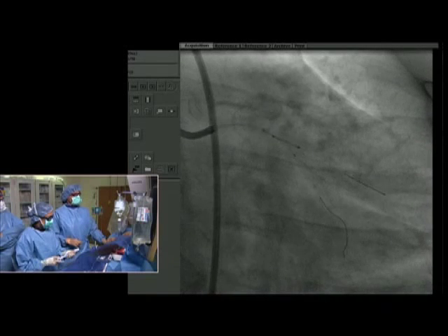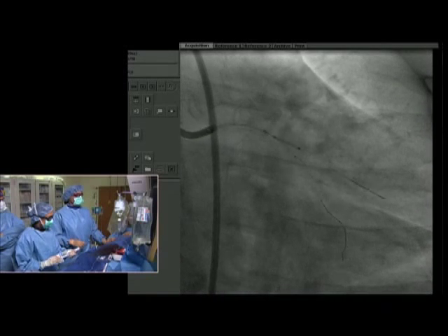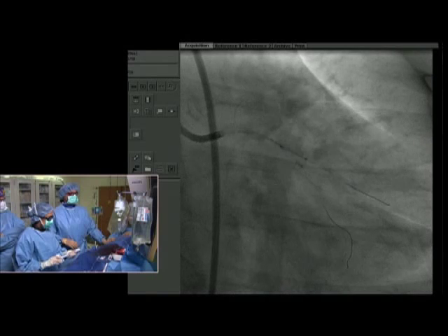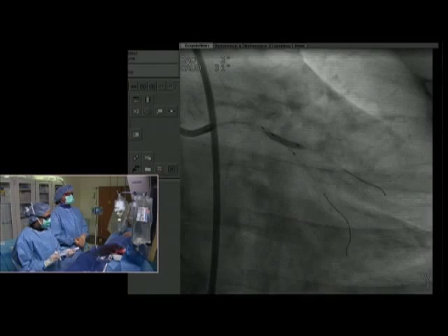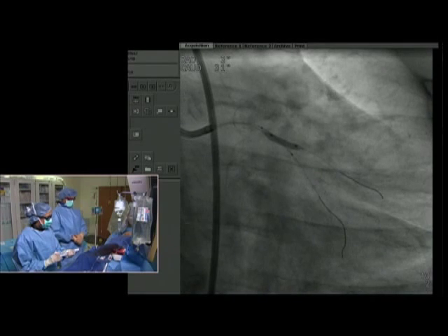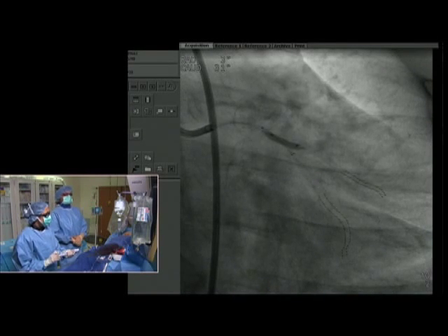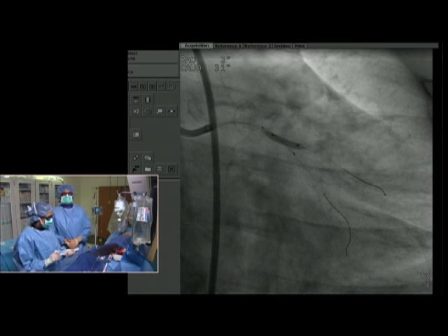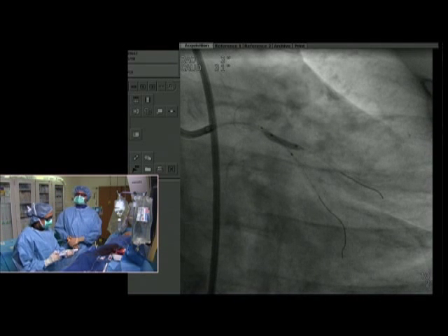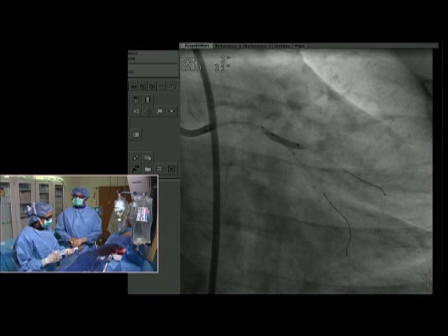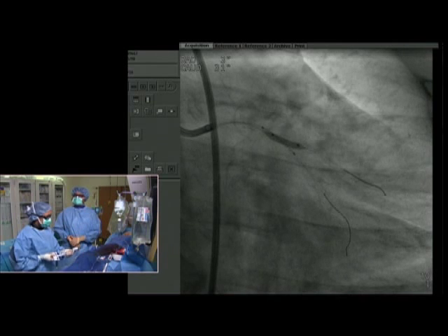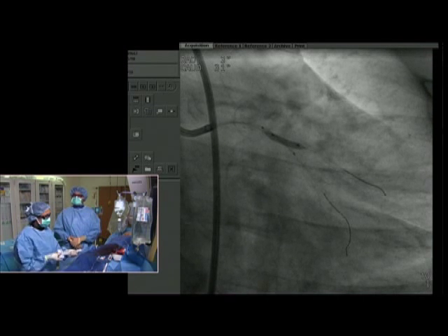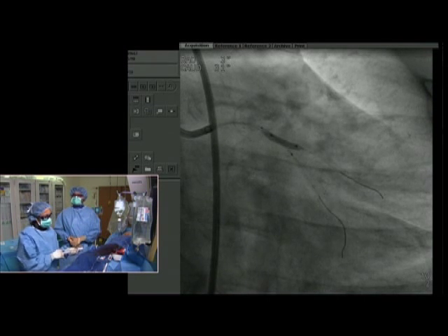We're deploying the stent in the main branch with that balloon jailed into the side branch at 10 atmospheres. Then we'll inflate the jail balloon to open up the side branch, and then we'll remove the jail balloon and wire.